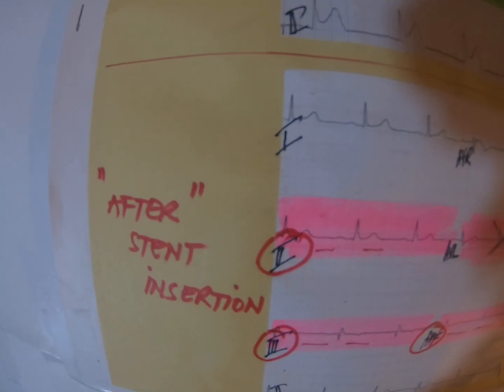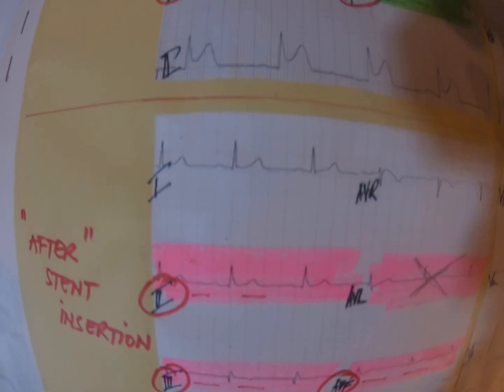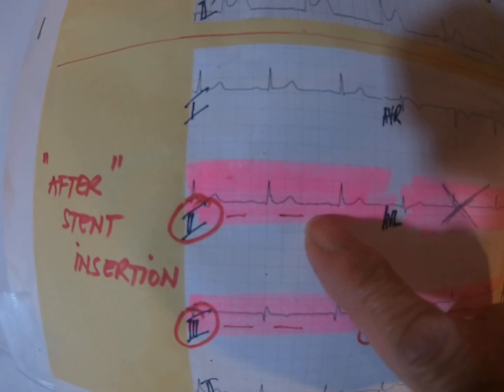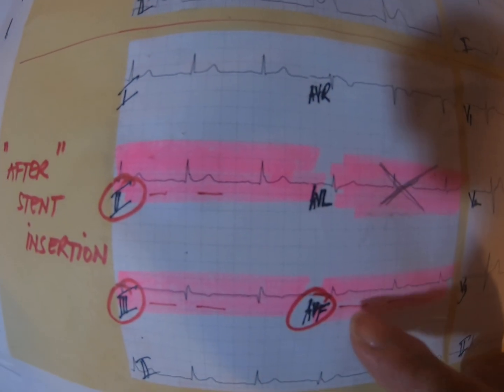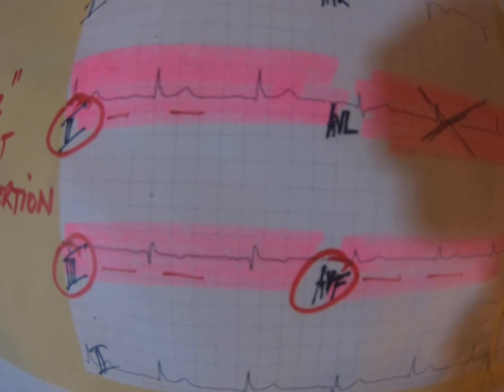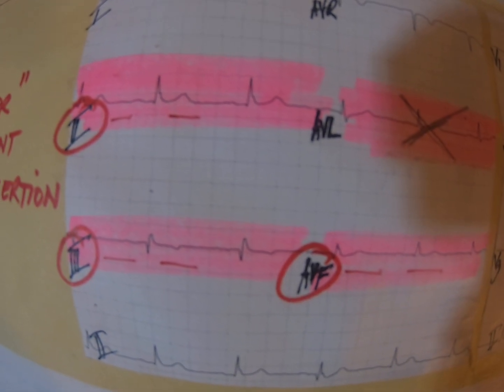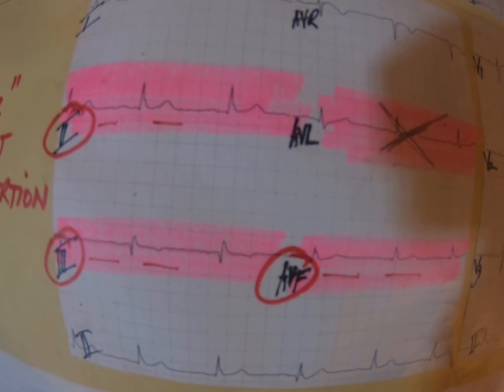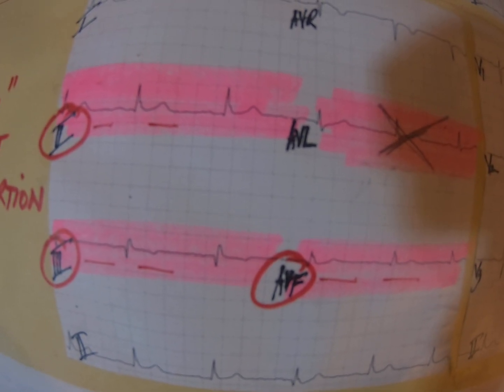This is after. You see that this ST elevation now looks isoelectric. Look, this was great. 2, 3, aVF. Good job by the team. That was good. Done early. Perfect. Very good. This is really good.